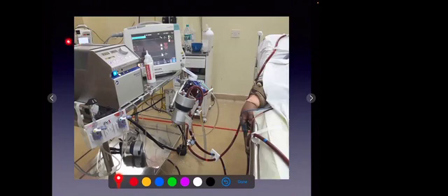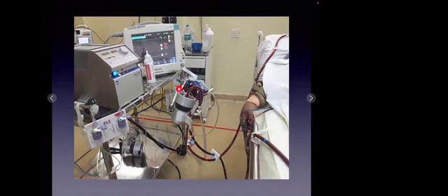The machine behind here you can see is the ACT machine, which is usually used to measure the ACT. And again, the same thing. This is the cannula which is coming in. This is the pump. This is the oxygenator, and this is behind the blender. And this cannula is going back.